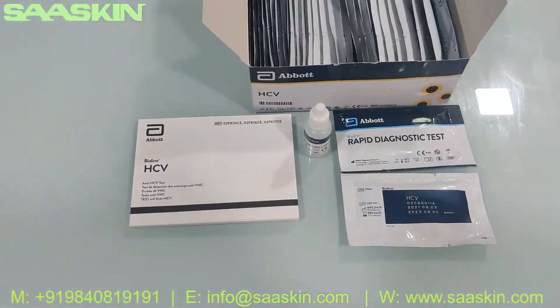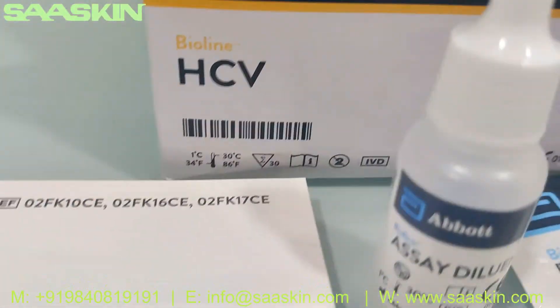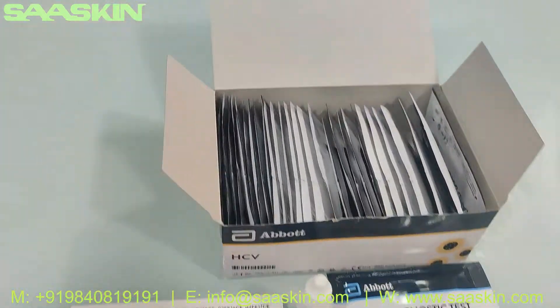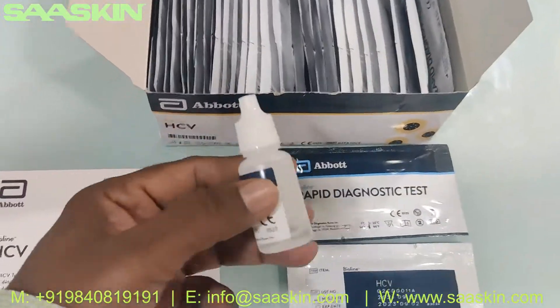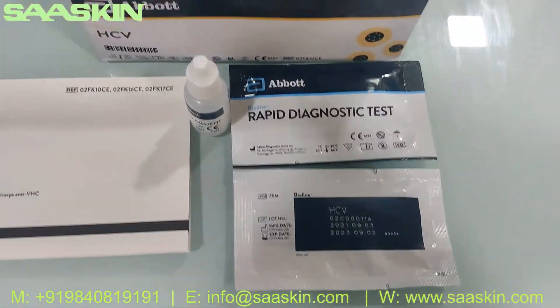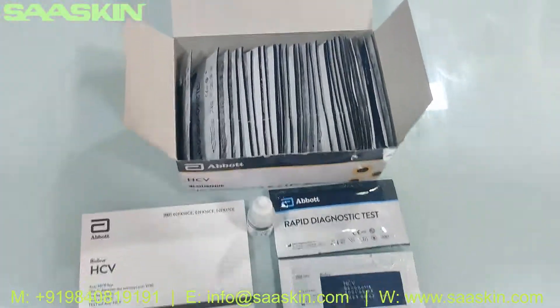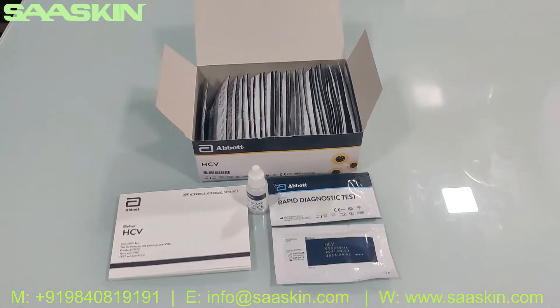So just quickly to summarize: this is the Abbott Bioline HCV Rapid test kit, which is a 30 test kit box. Inside the box you get an IFU booklet which has the complete instructions, you get a 5ml buffer bottle, and you get 30 cassettes. This is how the total box looks like — you have 30 test cassettes here. Thank you.